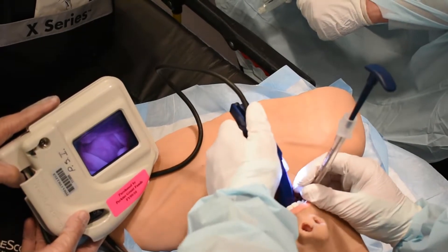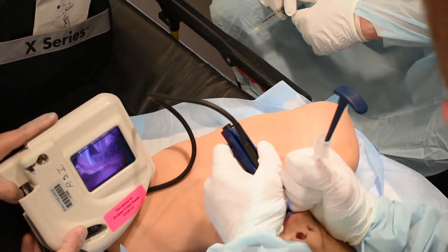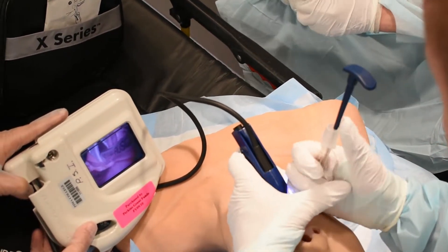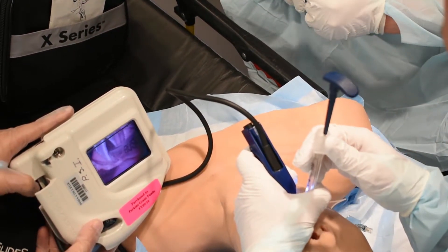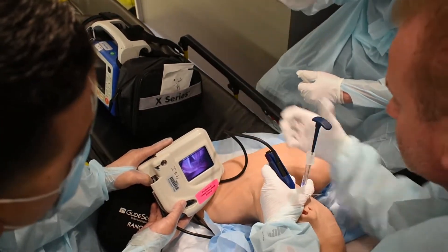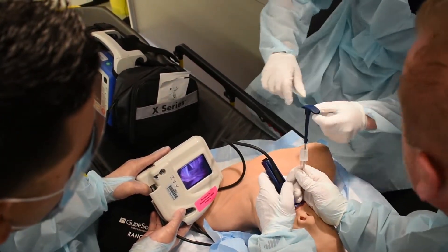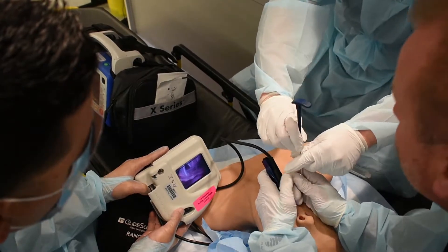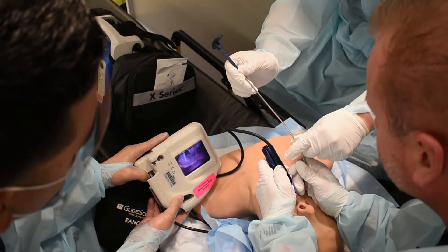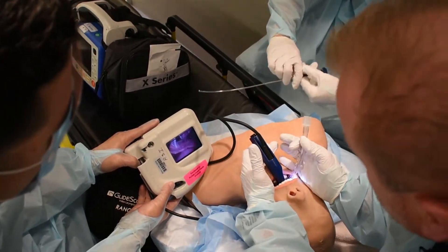A lot of people will now pull the stylet out under video guidance. With a rigid stylet, you need to follow the angle of the chest — do not pull it straight up. So pull the stylet out following that bend, bringing it down towards the patient's feet. That motion should be nice and smooth, and you should still be sitting at around 22 centimeters at the teeth.